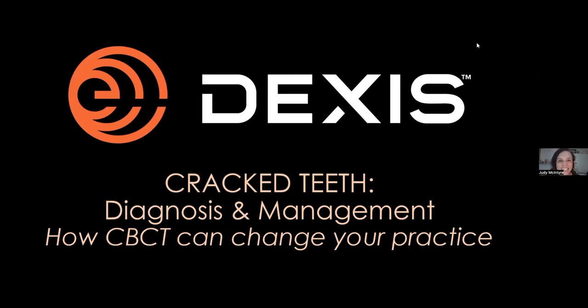Today, I'm excited to share my presentation about cracked teeth, specifically focusing on the diagnosis and management and how CBCT can change your practice regarding cracked teeth.